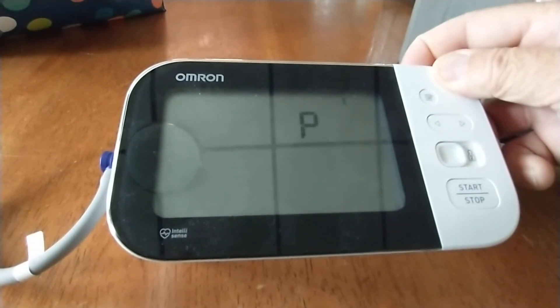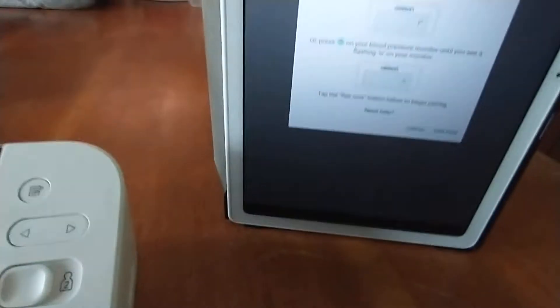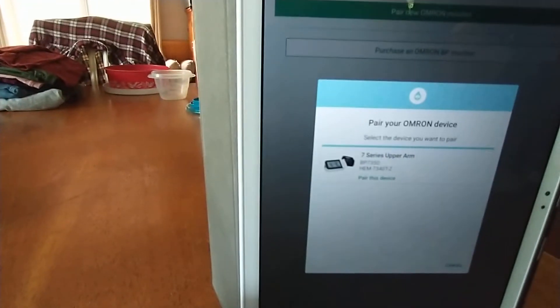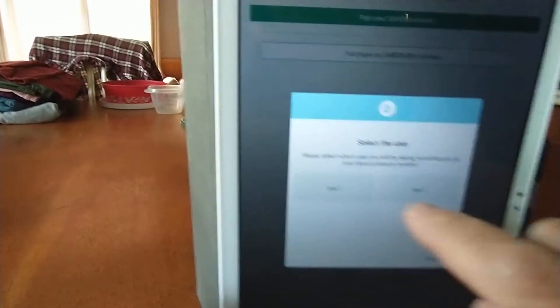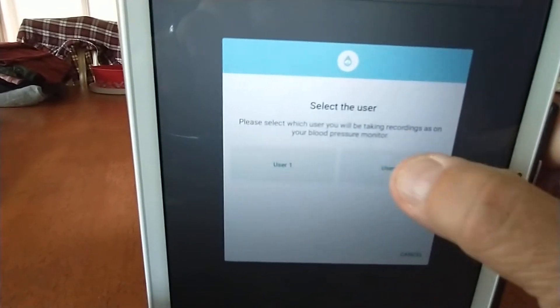So I'm holding it and there we go — I've got a 'P' on the display. So now we go back to the app and press 'Pair Now.' As you can see, it's found the monitor and we press 'Pair This Device.' Now in my case I'm User 2, so I press User 2.